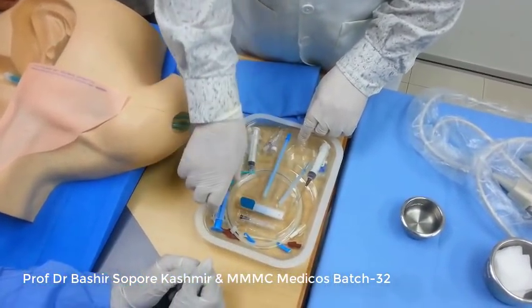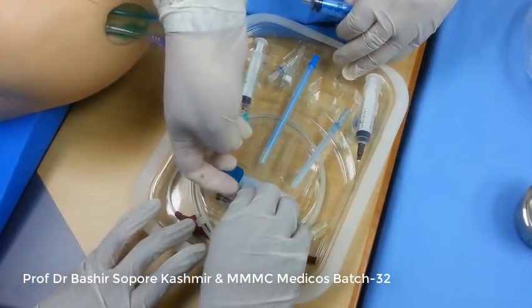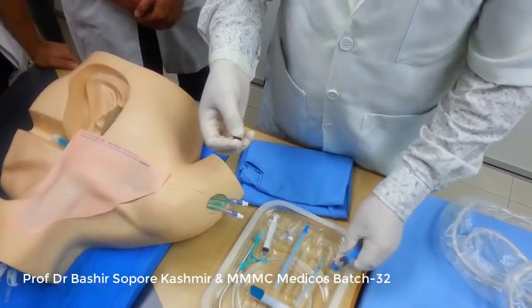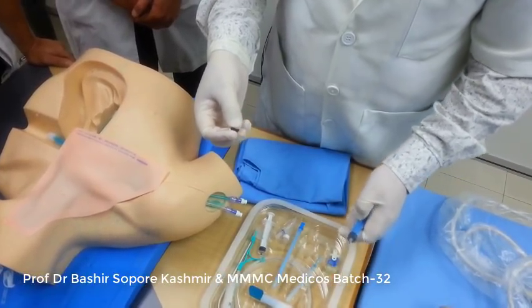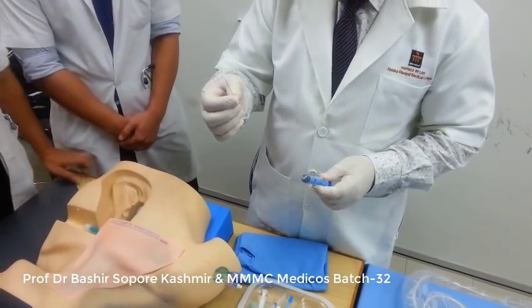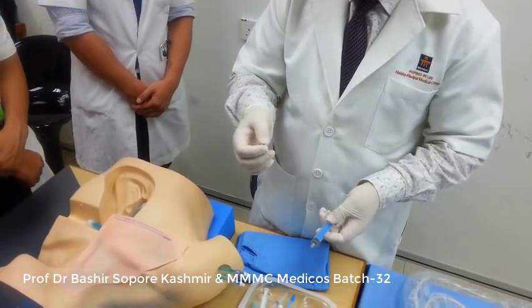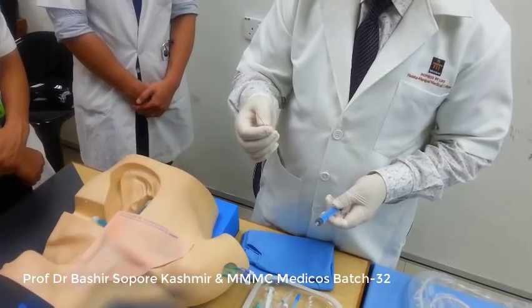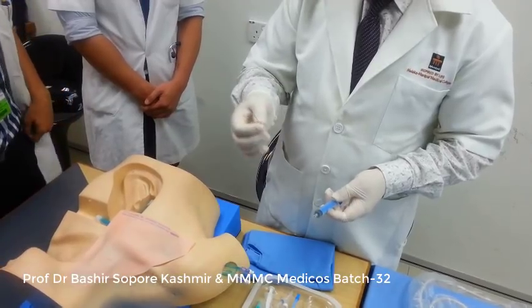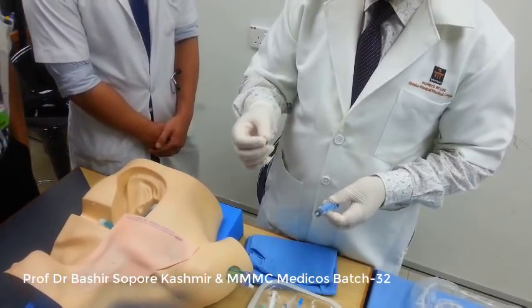Now let me show you the other needle. The other needle is a 22 gauge needle. It is slightly thicker than the first needle, and its length is around 1.5 inch. This needle is called a finder needle, and it is attached with the 5 ml syringe. This finder needle we use because we have to first find the jugular vein.